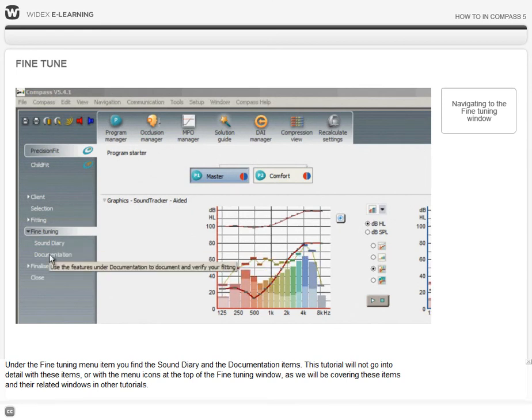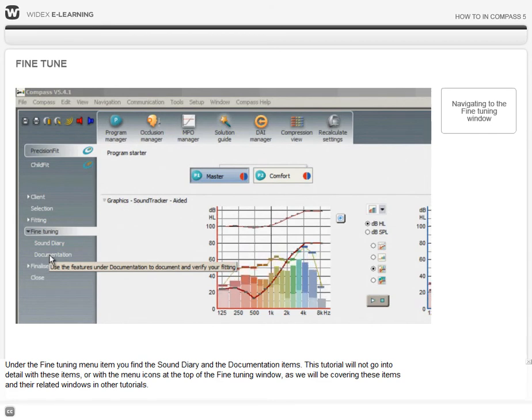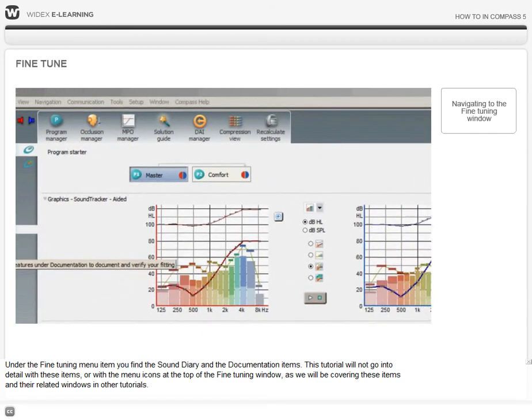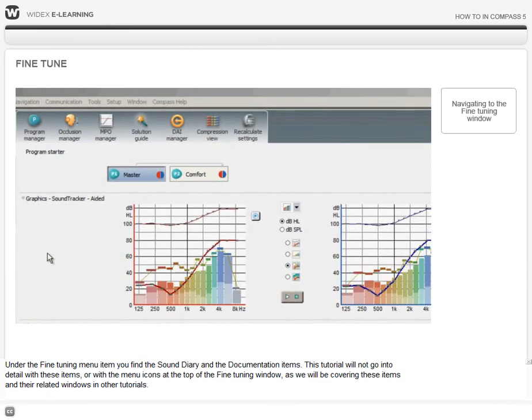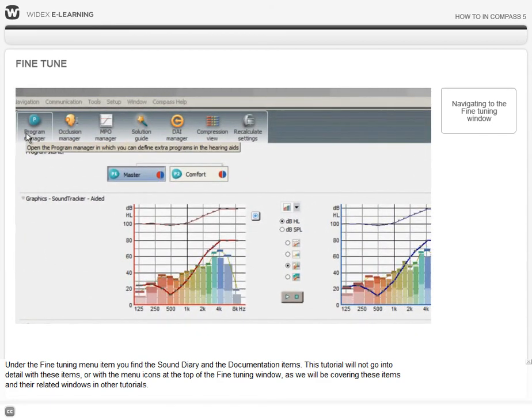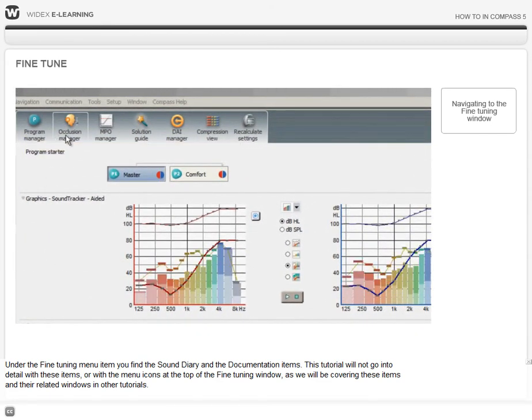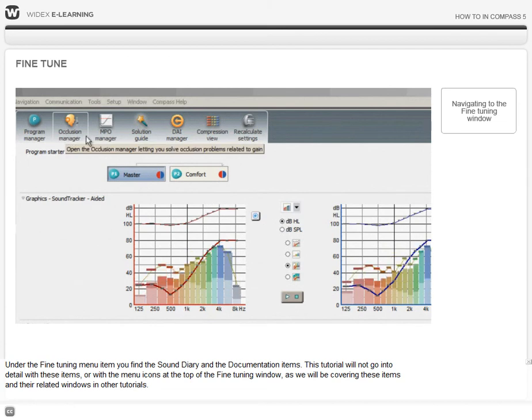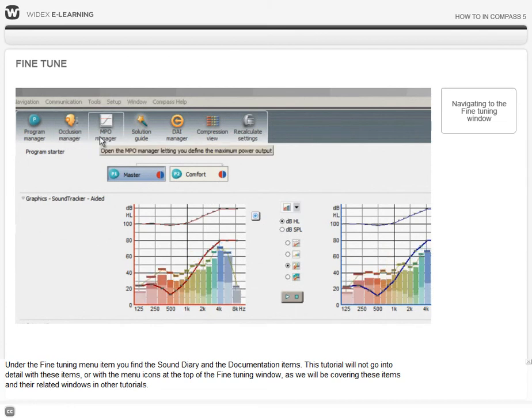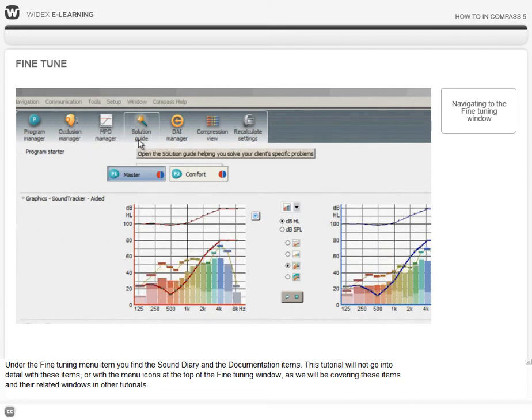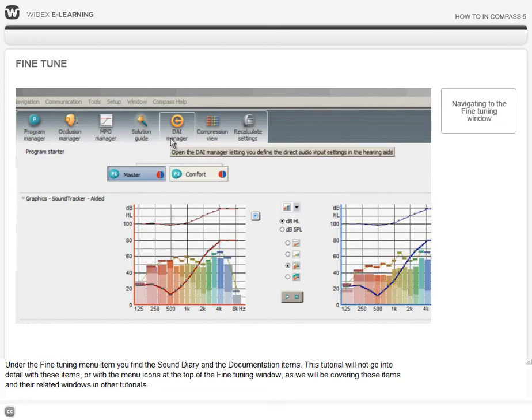This video will not go into detail with these items or with the menu icons at the top of the fine-tuning window, as we will be covering these items and their related windows in other videos.